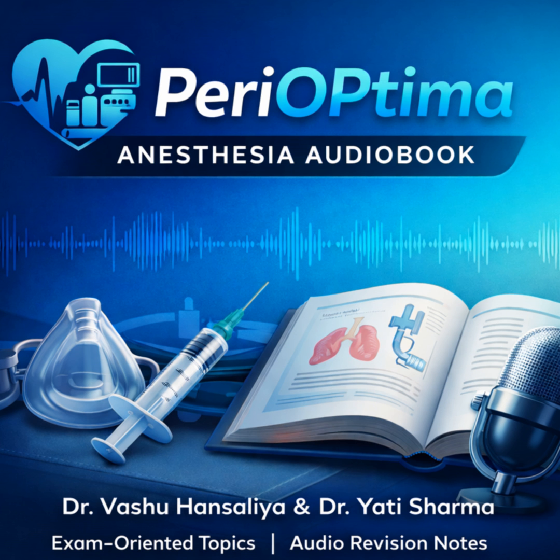The timing becomes very difficult because the RR interval varies from beat to beat. The machine struggles to predict when diastole will start. The efficacy of the pump can drop by as much as 50%. And tachycardia, also bad. Tachycardia shortens the diastolic time, that's the time the balloon actually has to work and perfuse the coronaries. Yep, so you need to control the rate aggressively.